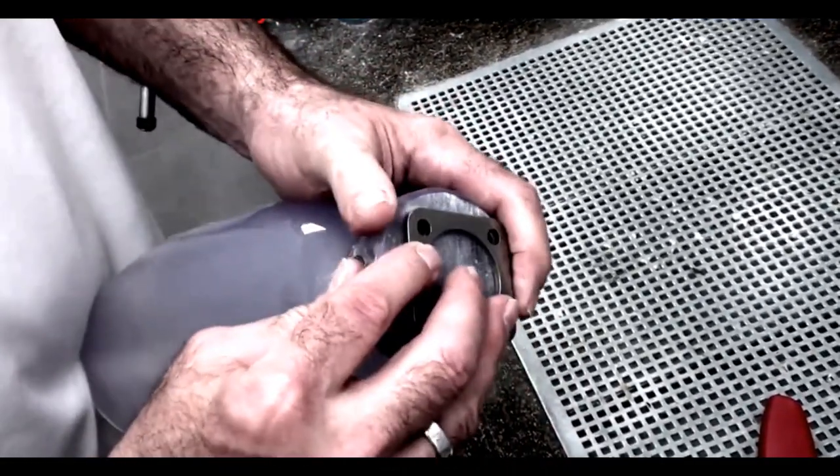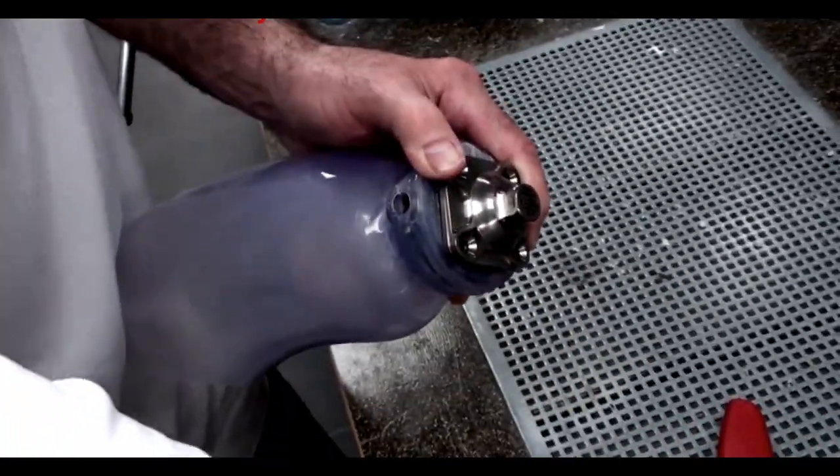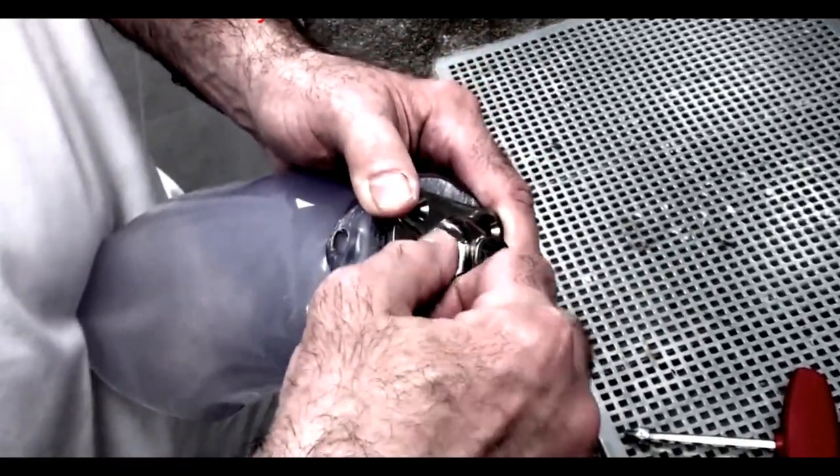Then you need to apply the spacer plate and attach componentry so that the rest of the prosthesis can be assembled.